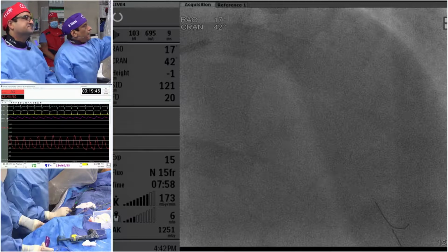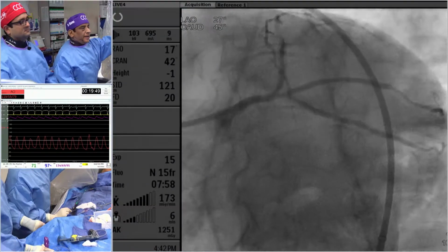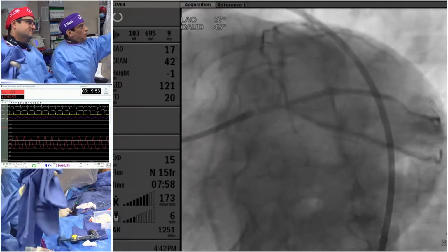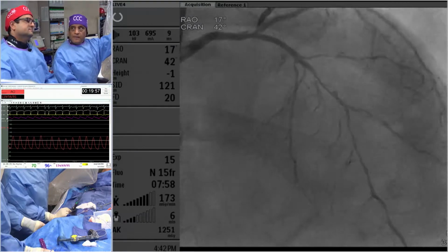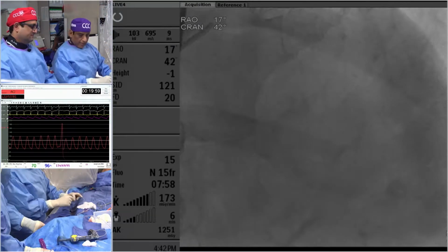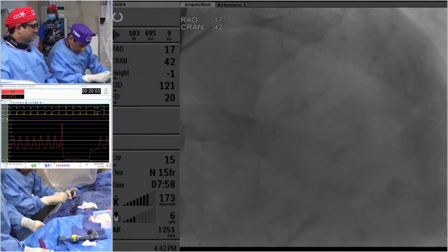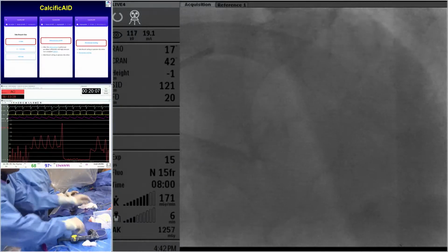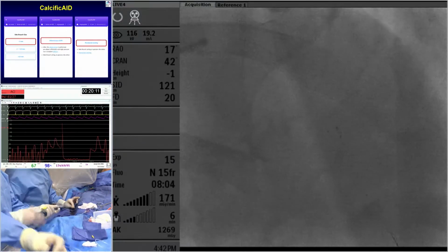And it's very hard to... Yeah, you're right. Look at this. If you want to review that here, you don't see it at all. Nothing. There is almost no left main disease. Now you go to this view, then you see that ulcer. Yeah, I think that I would like to use intravascular imaging here to get confirmation. Yeah, we're getting the IVUS ready here, yes. Some people will say we want to do FFR, but because you have an ulcerated plaque, I would feel more comfortable if this is being fixed. Yeah, that's a good point.